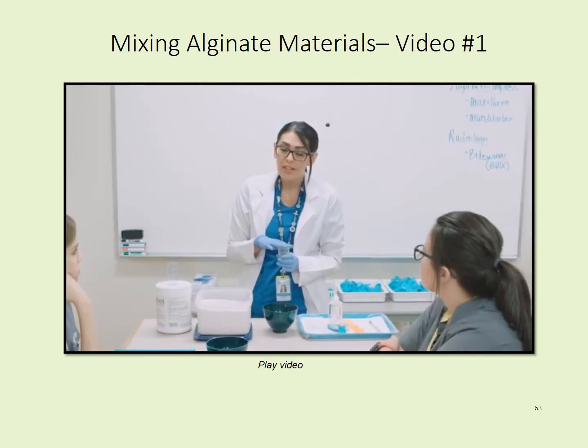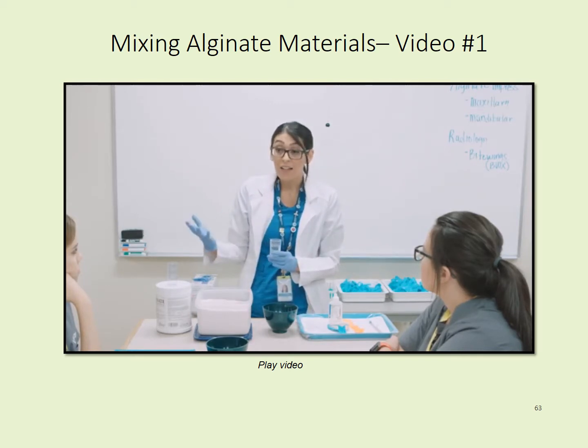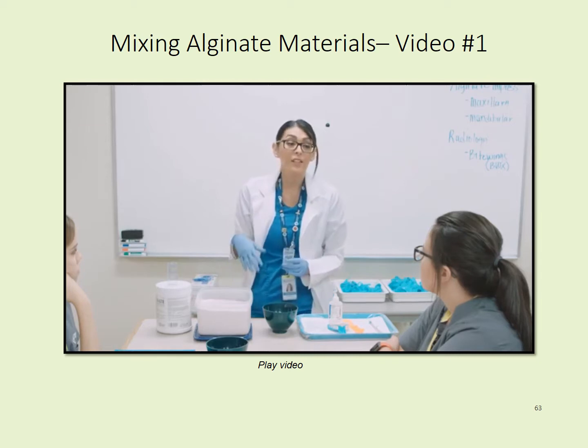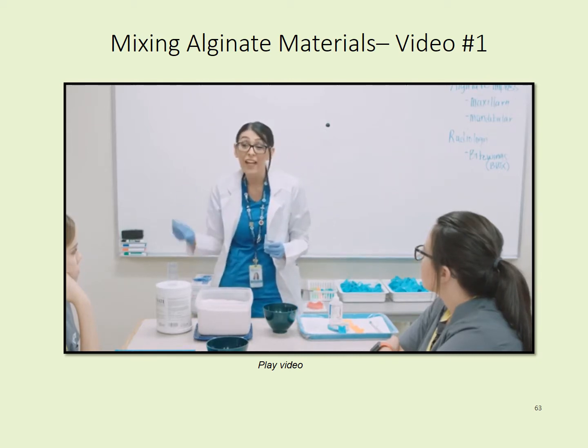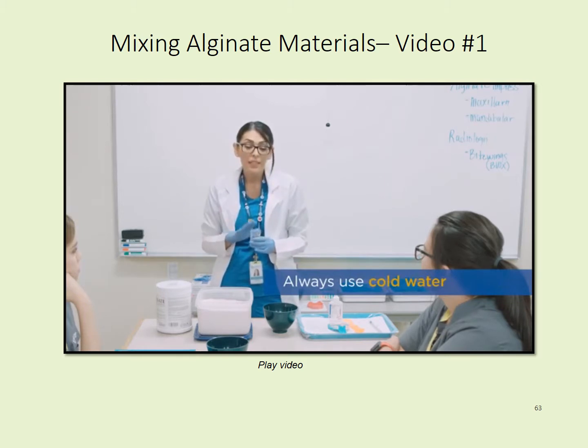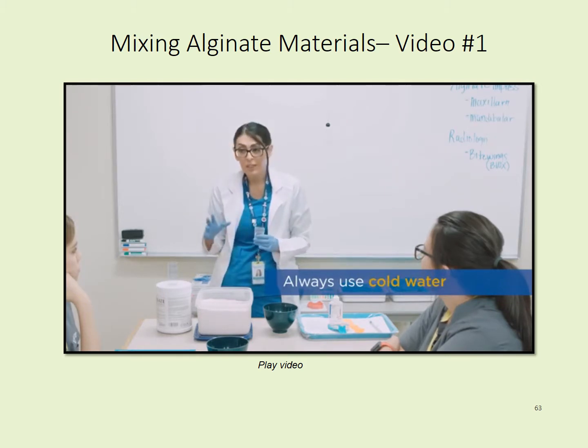The temperature of water makes a very big difference when you're mixing alginate impressions. Temperature affects a lot of things in dentistry. If the water is hot and we start mixing this alginate, the alginate impression material is going to set faster, which means that we have to speed it up. So every time you mix an alginate impression, you want it to be cold water.